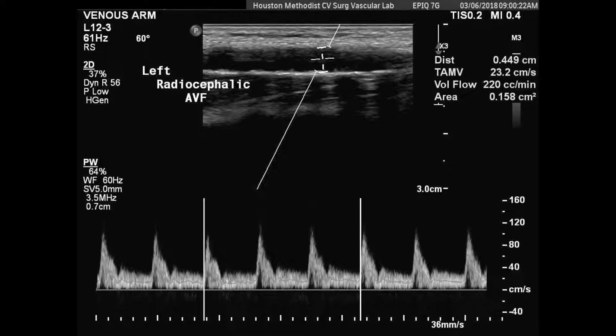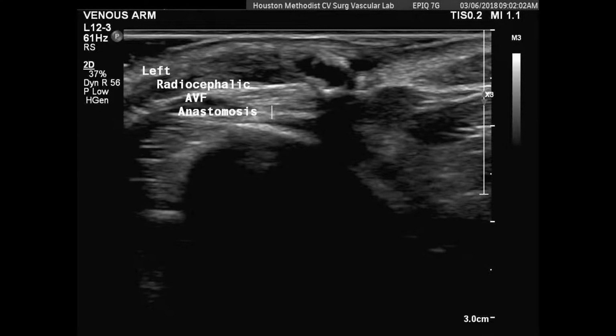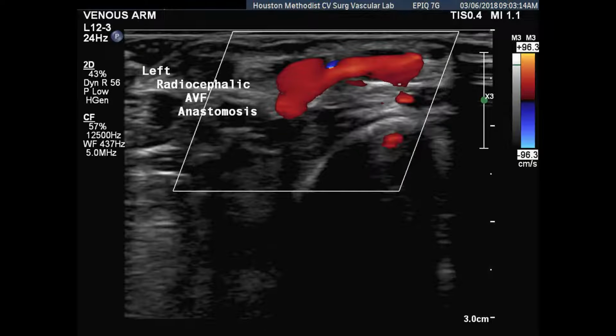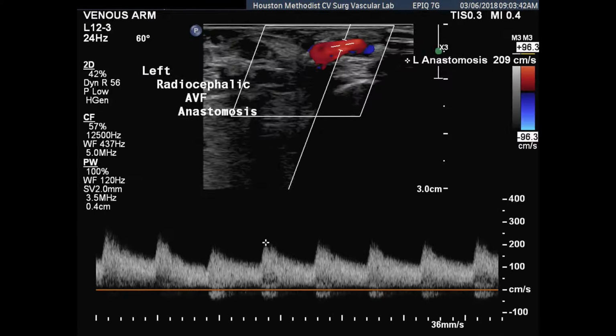So definitely low flow, and you'd say, why is that, right? So I think we'd agree you have a nice sharp upstroke, so it's probably not arterial inflow disease. It looked like as you were scanning through there that there's some radial artery calcification. You wonder how much that's an issue, but then also almost certainly the anastomotic issues that we've seen before on the previous sweeps are probably related to the low flow. But that's definitely low, right? It'd be unlikely to get adequate dialysis through that.